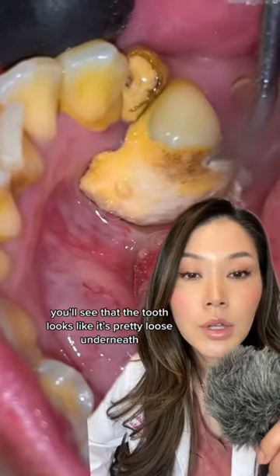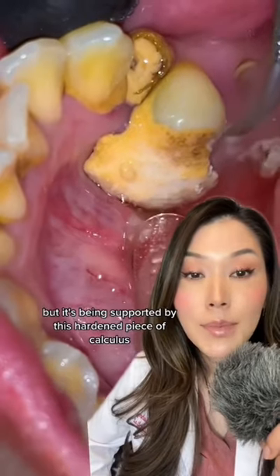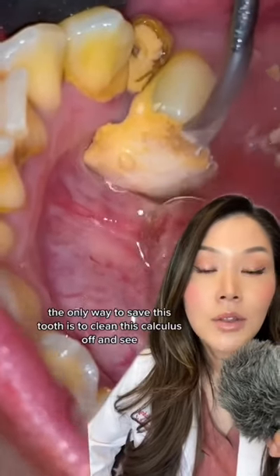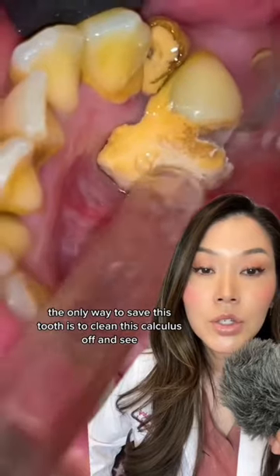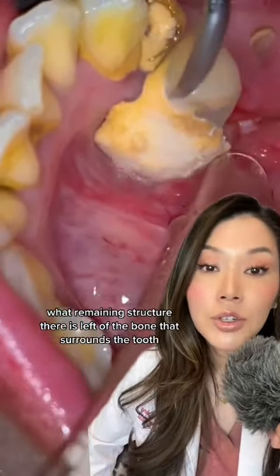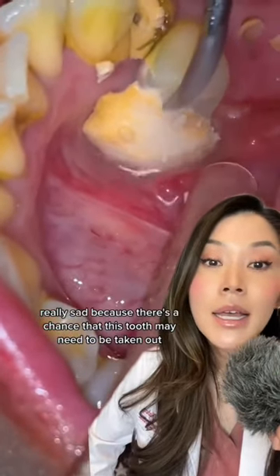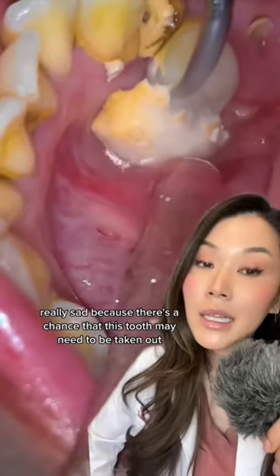You'll see that the tooth looks pretty loose underneath, but it's being supported by this hardened piece of calculus. The only way to save this tooth is to clean this calculus off and see what remaining bone structure surrounds the tooth — which is really sad, because there's a chance this tooth may need to be taken out.